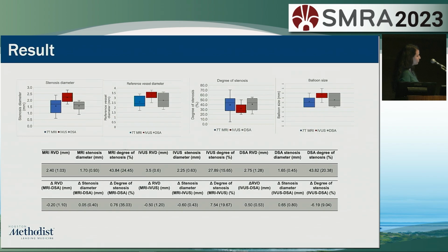In this particular model and in vivo, during IVUS, they usually use saline to inflate the vessel, which might be able to bias the results ultimately. But the conclusion and the most exciting part of our experiment was the multimodality approach.